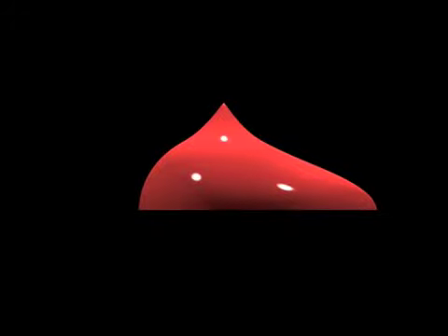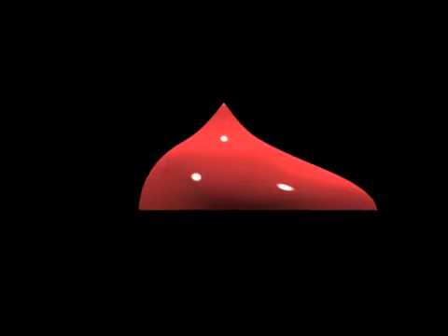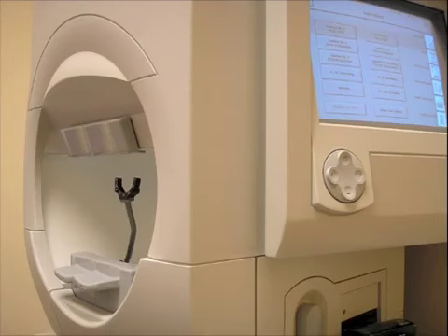So far we have looked at field defects as being absolute. In practice, the visual field is like an island of vision, with the centre of the vision being most sensitive. This means a small or dim target can be detected centrally just as easily as a bright or large target is detected peripherally. Accurately mapping the shape of this island of field allows for early detection of problems and to demonstrate changes over time. Two machines are in common use in the UK to assist with this.